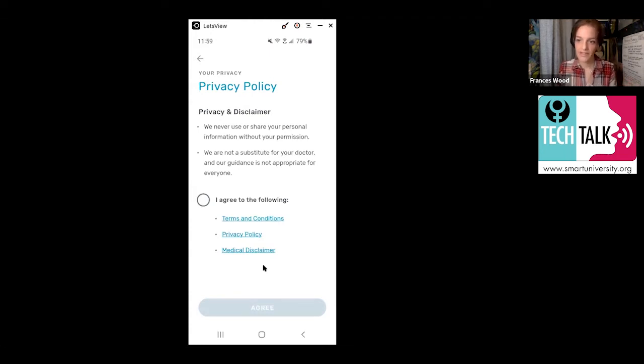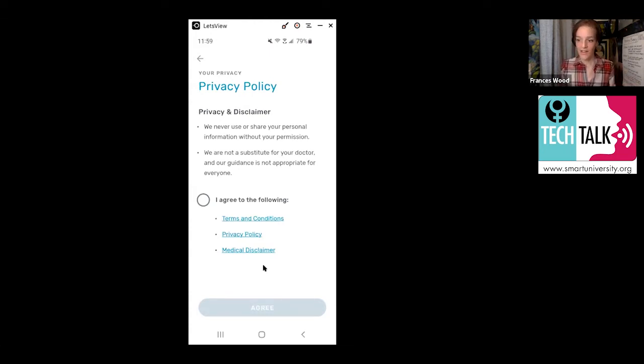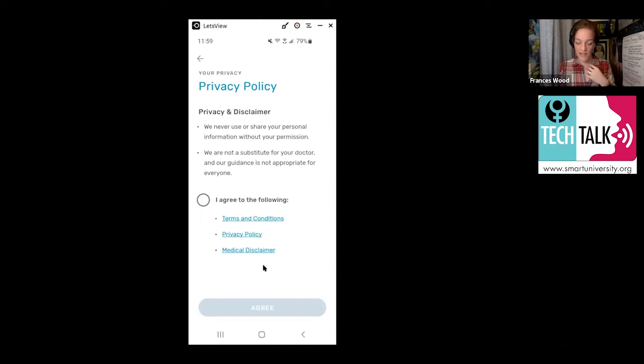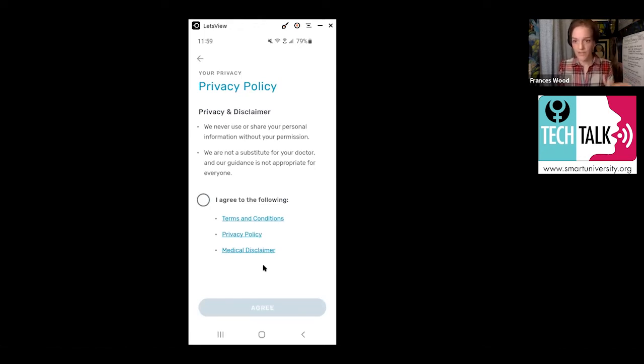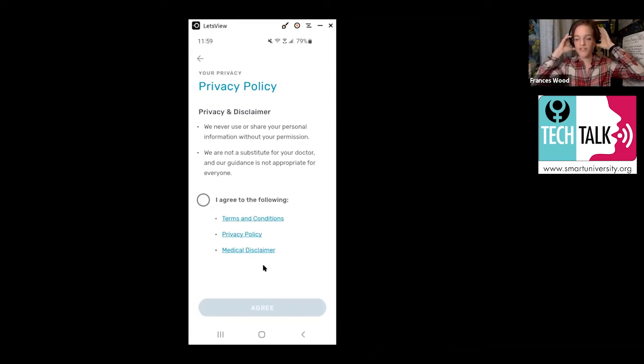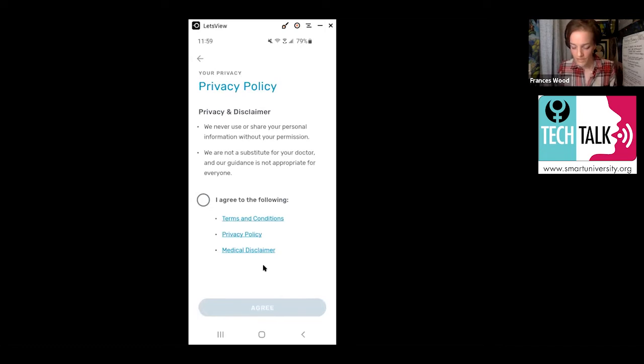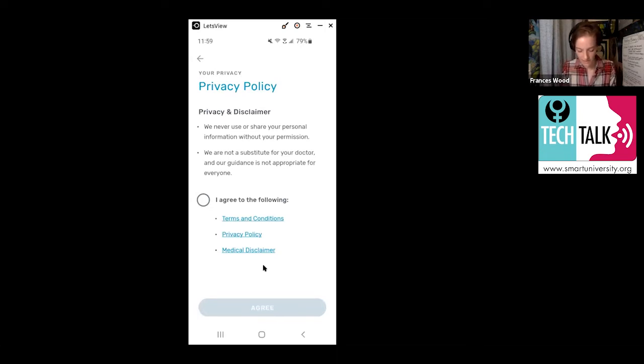That just goes into the general data for the area, but it's never linked back to you. So you can feel OK about knowing that. Also, they're making the disclaimer that they're not a substitute for your doctor. This is all advice, but you can always contact a doctor or emergency professionals if it's that serious. So once you say I agree to the following.